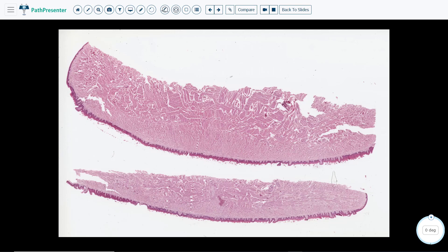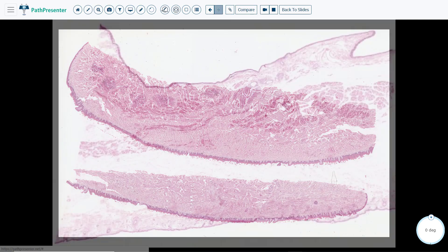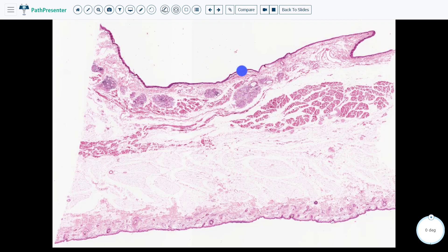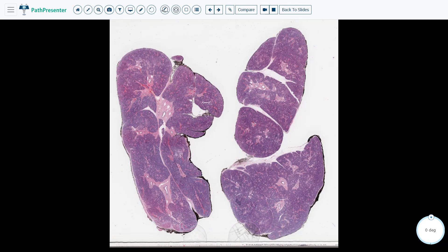The first case is normal tongue, reviewed in a separate video. The second slide is normal buccal mucosa — the normal buccal mucosa is up here and the skin is down here, also reviewed in the same video as the tongue. The third slide is normal parotid gland, reviewed in a separate video.